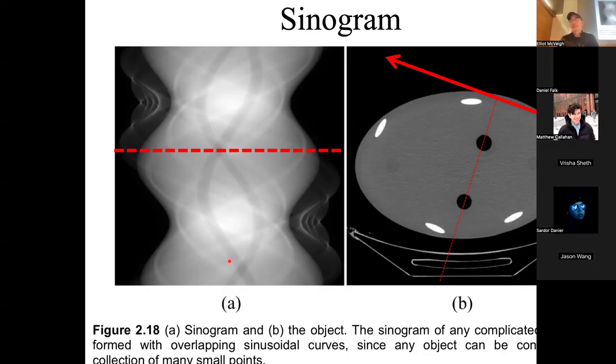If you really know CT, you can look at the sinogram and take a guess what the picture looks like. But that's very hard, right? It's extremely hard to do. Oftentimes, if the picture has artifacts on it, as we'll see, something is wrong with it, you can look back at the sinogram and it'll tell you what went wrong. We'll take a look at a couple examples of that. So this is G(L, theta) over here, and this is mu(x,y) that we've got, okay?